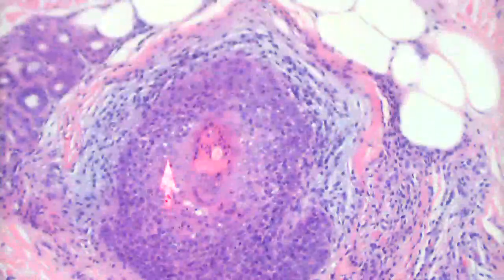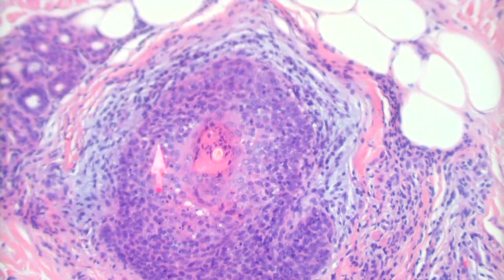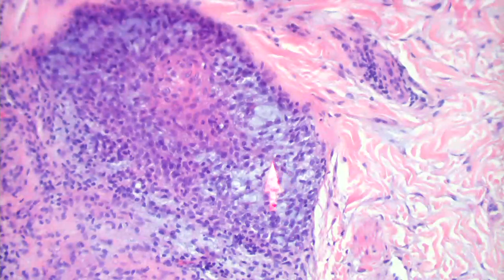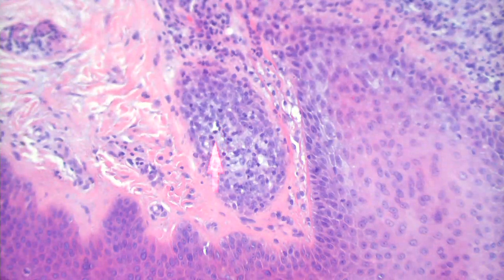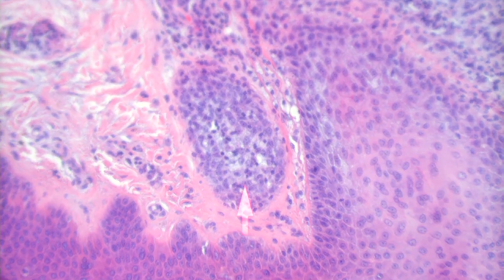It is a follicle. And there's some mucin in the stroma surrounding it here, but also if you look inside the epithelium, yeah, it's in there, or between the epithelial cells here. So what do we call that? Follicular mucinosis. And what are the settings where you can see that? You can see it in lupus, I think. What are the two main settings where we see follicular mucin?